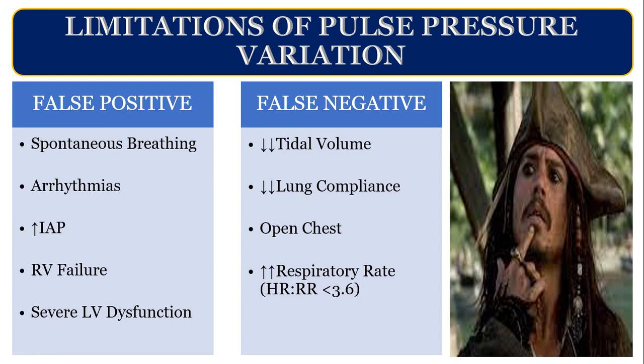How many of you have seen a pregnant lady with H1N1 pneumonia? We were unlucky enough in 2009, where we have seen a lot, and we have seen a lot of death also. So they used to have bradycardia and very high respiratory rate, and to maintain the CO2 you tend to give more than 35 respiratory rate. So here you will get a false negative PPV, SVV.